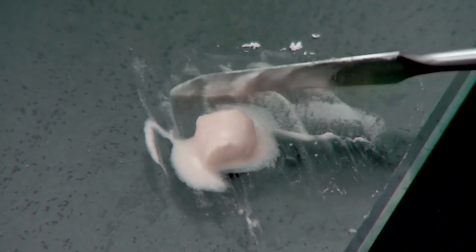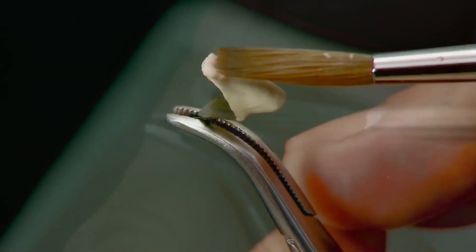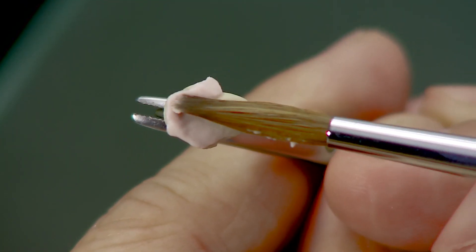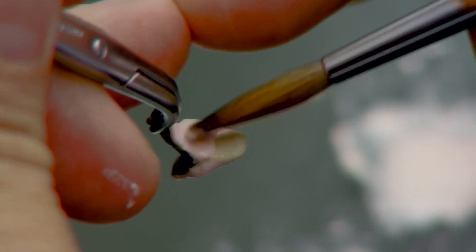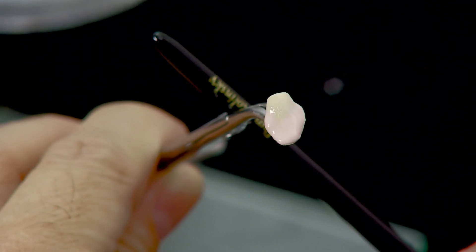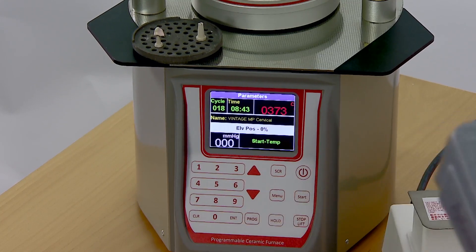Vintage MP Mixing Liquid HC improves handling qualities of the porcelain, which remains moist for a longer time and holds the powder particles together, enabling easy buildup. Scoop up the adequate amount of porcelain mixture with a clean brush and build up the cervical area. Condense with a brush shank — the cervical area should be fully condensed to minimize shrinkage after firing. Set the porcelain furnace to the cervical firing program and fire.